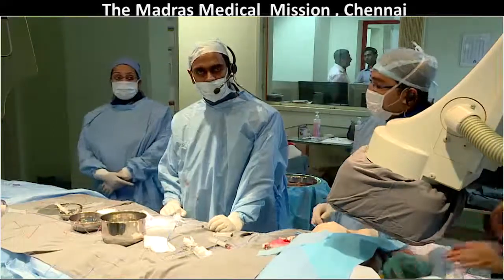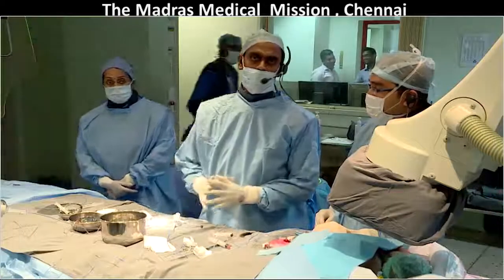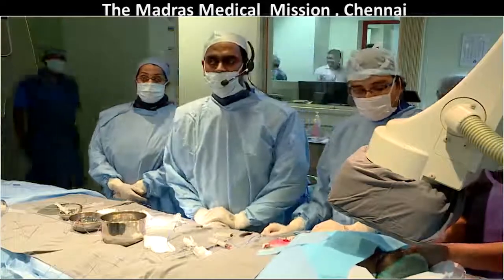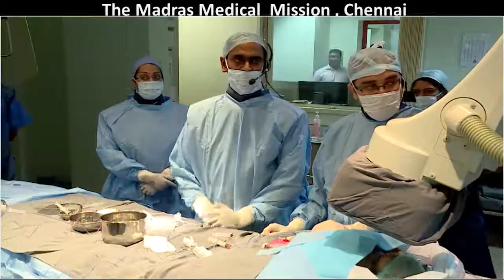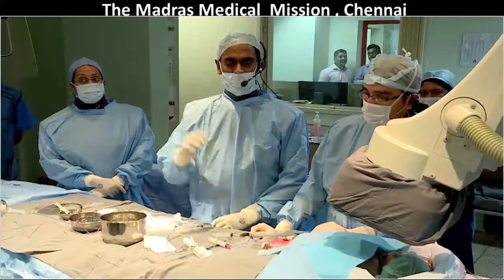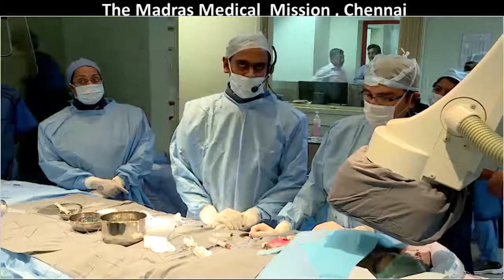Before you go on any further, I'm confused. Do the pulmonary veins drain normally to the left atrium in this patient? Correct. Actually, the anatomy that was present was a window-like communication between the undersurface of the right pulmonary artery and the roof of the left atrium, which causes a shunt of blood from the right pulmonary artery directly into the left atrium.